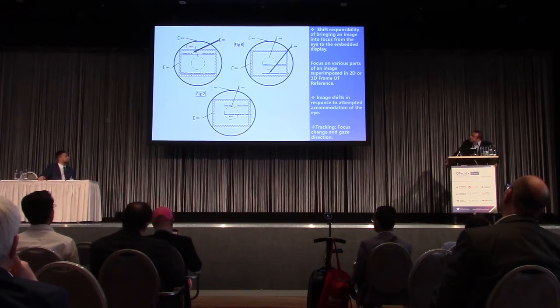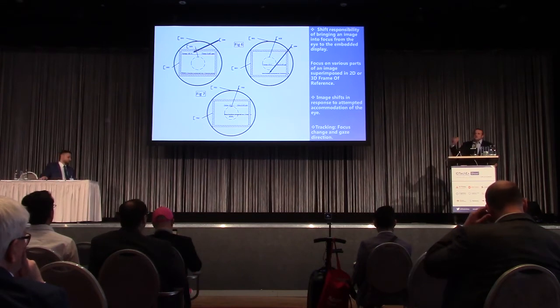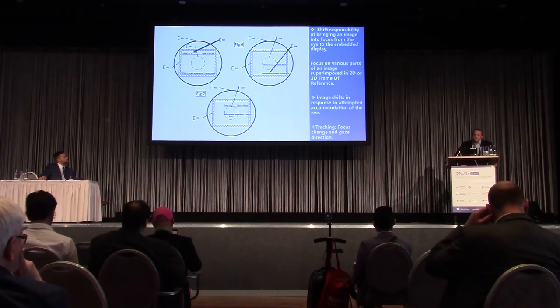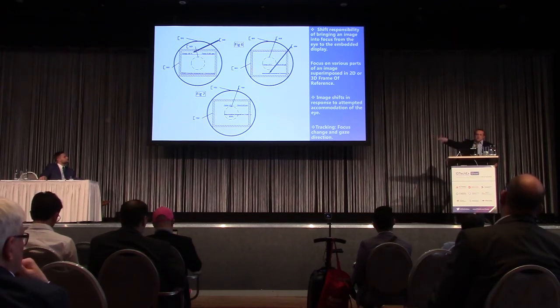There is also three-dimensional, which I don't have an example for, but the idea is basically the image needs to be superimposed with respect to external geometry. Let's say you're running Microsoft HoloLens and you are executing Amazon Prime, you're running a movie, right? You can, with your hand, attach that application to the wall, and it'll stay on that wall regardless of how you move your eyes or your head. So this is a three-dimensional frame of reference, but the basic idea is pretty much the same.